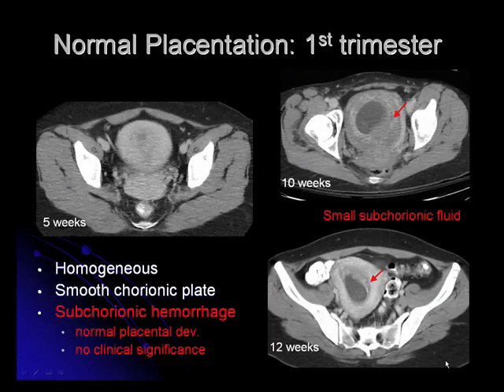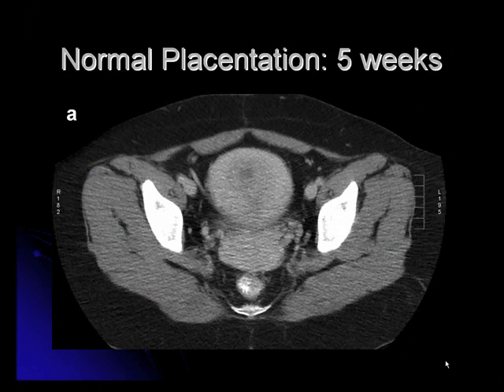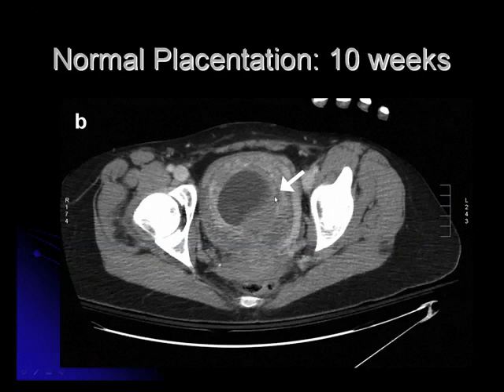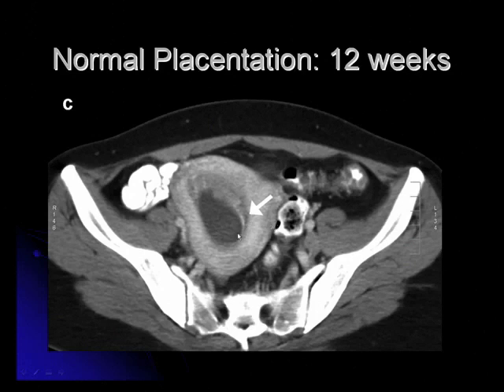These are some examples of normal placenta during the first trimester. Early on, at five weeks, the appearance is very homogeneous and there's a smooth chorionic plate. Later on in placental development, you can see subchorionic hemorrhages, which appear more heterogeneous but are of no clinical significance. At five weeks, the placenta is not distinguished from the uterine components and there is no evidence of a fetus. At 10 weeks, the placenta is a little more heterogeneous, and there are subchorionic fluid collections developing, demarcated by the white arrows. Pretty much the same thing at 12 weeks.